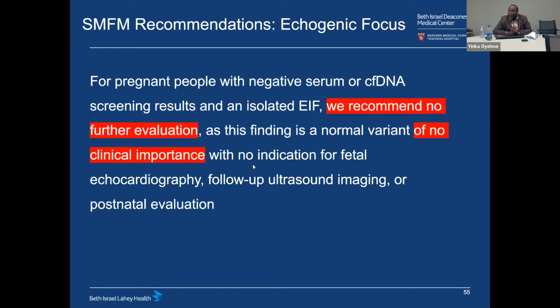They didn't say could be a normal variant. They said it is a normal variant of no clinical importance. So when you see the echogenic focus and it's isolated, it has no clinical importance. There is no indication for fetal echocardiography, follow-up ultrasound imaging, or postnatal evaluation. If at all we tell the patient anything about it, we should say it is normal.